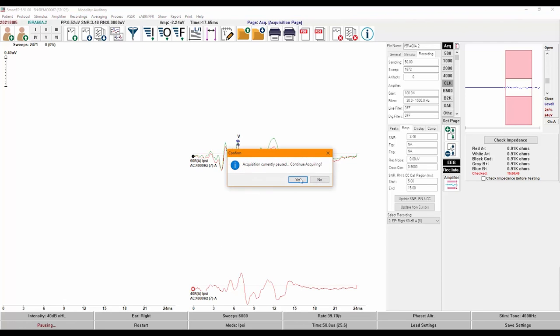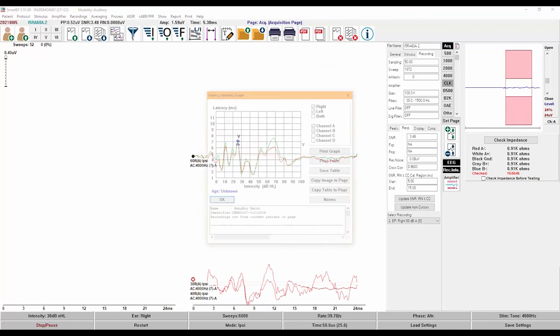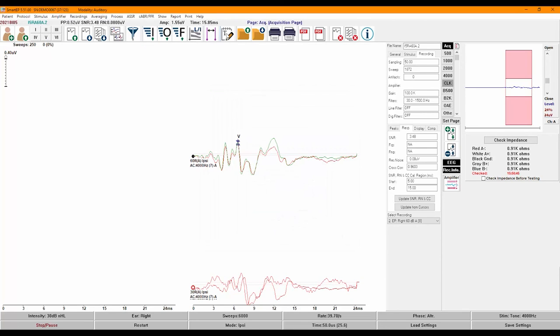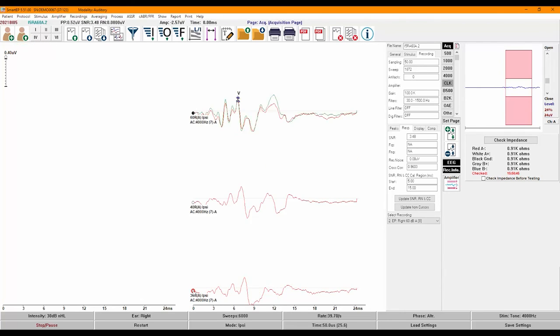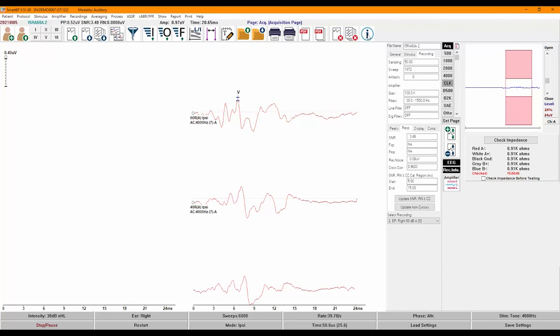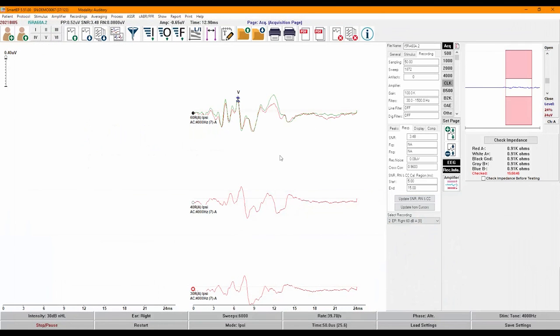The next button opens the latency-intensity function, which will automatically be plotted based on the labeled recordings on your page. You can add notes to the page. The last set of buttons are used to save or load a previously saved report, as well as printing or generating a PDF of the report. For those who often fax reports, there is a feature to increase the thickness of the waveform to make them more visible when printed. Finally, you can clear recordings either from the page or from all pages. The I button takes you to our manual for more information.